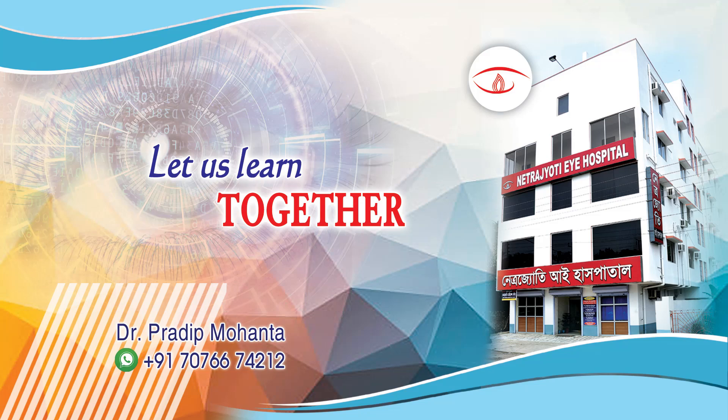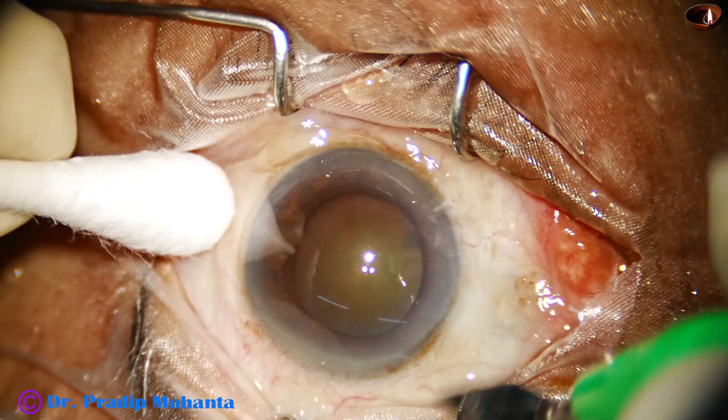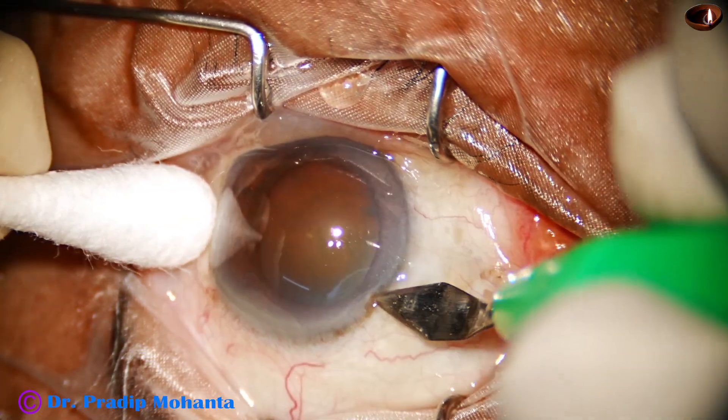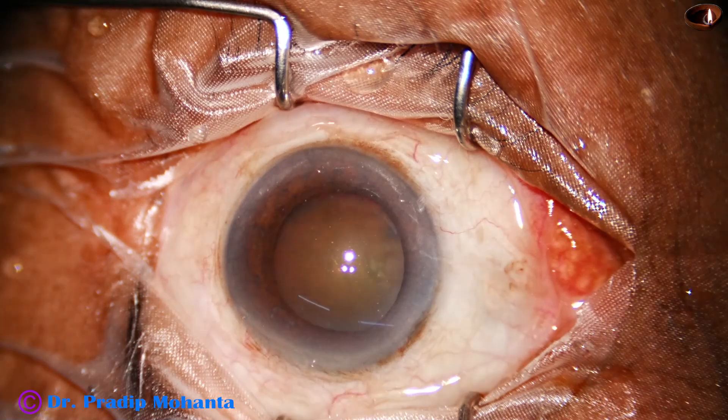Let us learn to use the B-Octa pupil expansion device through this video. This is a very interesting surgery. This is a cataract with grade 4 nuclear sclerosis. At this time, the pupil is well dilated, with a size of about 7 mm.